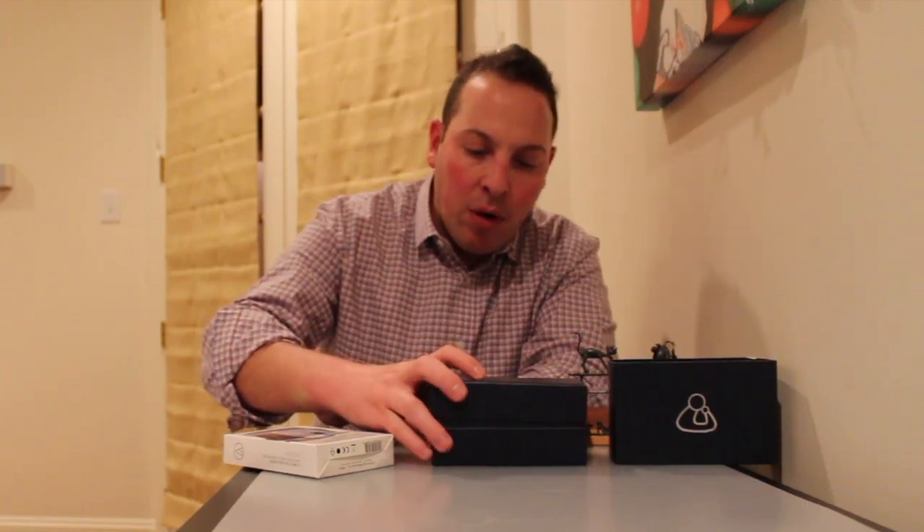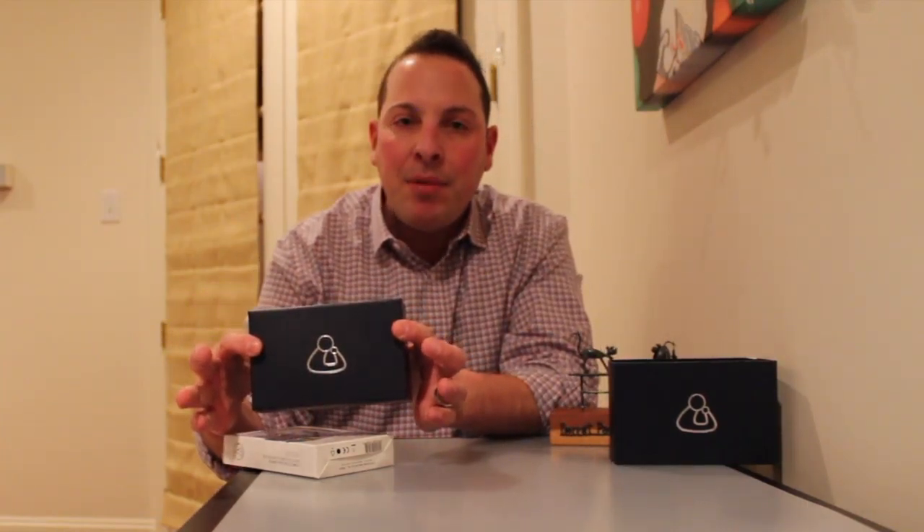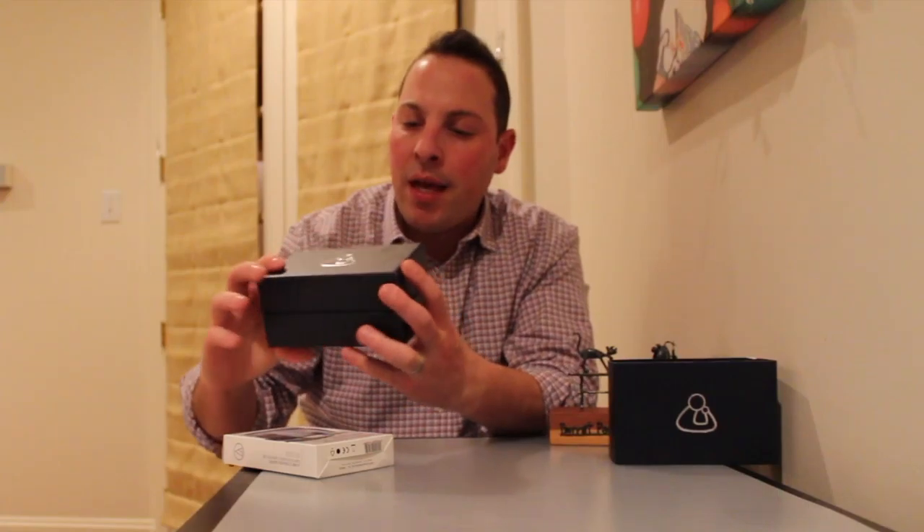Hey, Veterinary World. Garrett Pachtinger, criticalist and tech-savvy veterinarian here. Today I want to talk to you about a new device that I found. I've always been intrigued by technology and digital media, and I was in the market for a new stethoscope, and I came across the ThinkLabs digital stethoscope. I'm pretty excited.